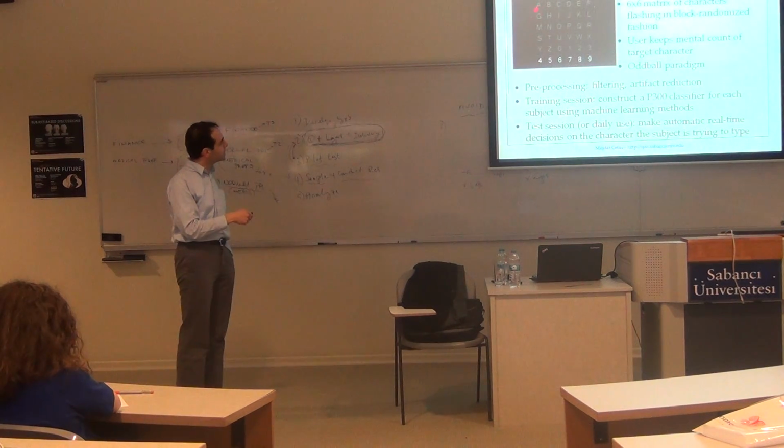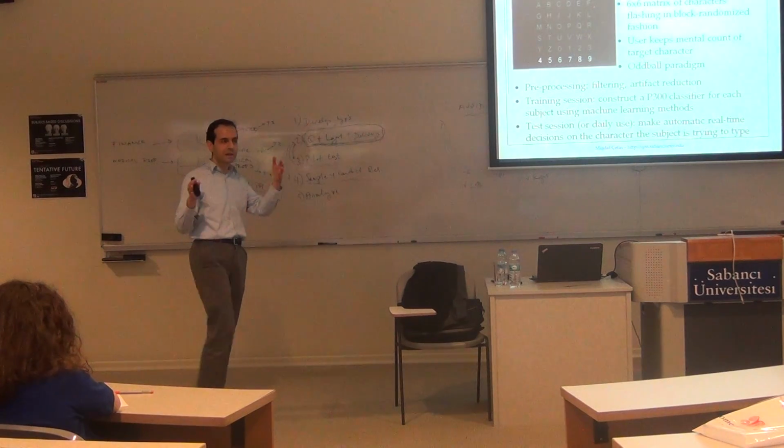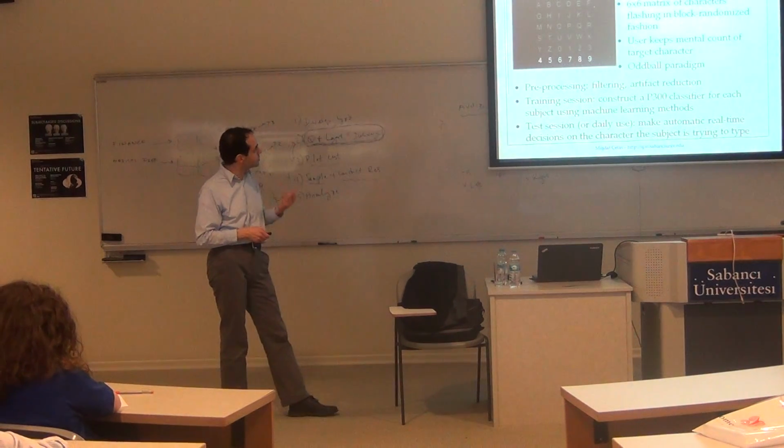Based on this, you can detect it. Of course, you are recording the EEG signals, you know when the rows and columns have been shown, and you know the piece of data that corresponds to the time when a certain letter or certain row is displayed.